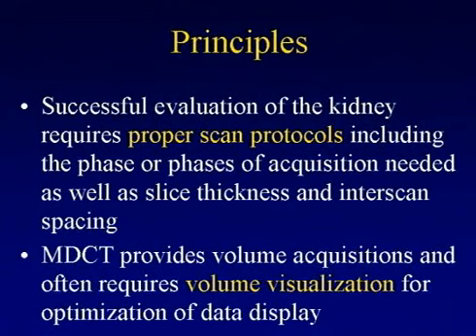And what I'll try to do in my time today is really look at CT of the kidney from a vascular perspective, from CTA, where things are going. And I think one of the things we recognize is there's tremendous capabilities these days, more than ever, for valuing the kidney. Regardless of our capabilities, our ability is related to how we do the studies. Scan protocols from phase of acquisition to slice thickness to scan spacing is critical. And also the concept of CT being an axial mode is something that's really disappearing.